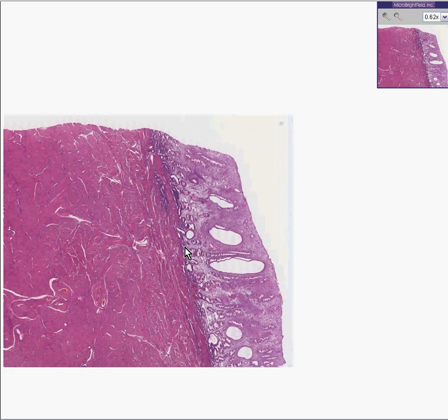Thank you very much. This is the world's nicest picture of secretory endometrium.